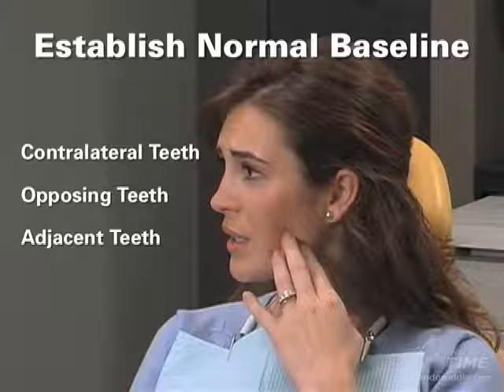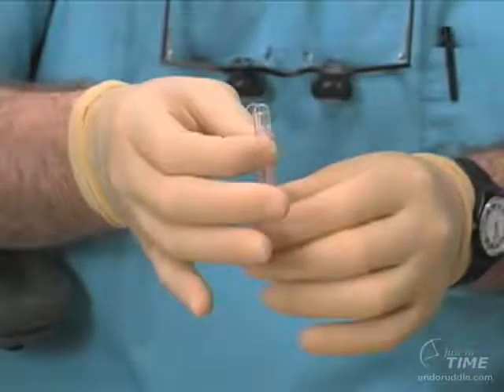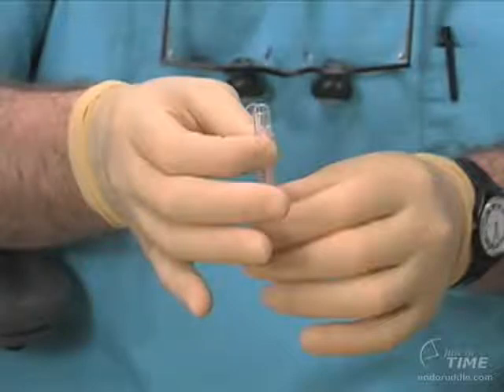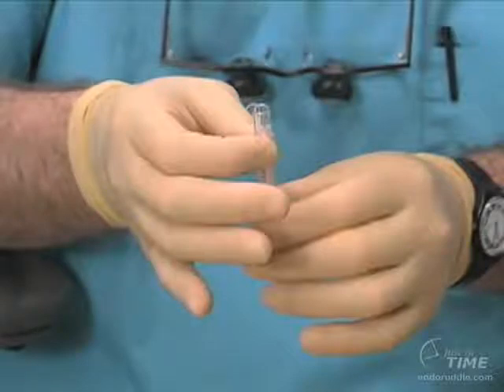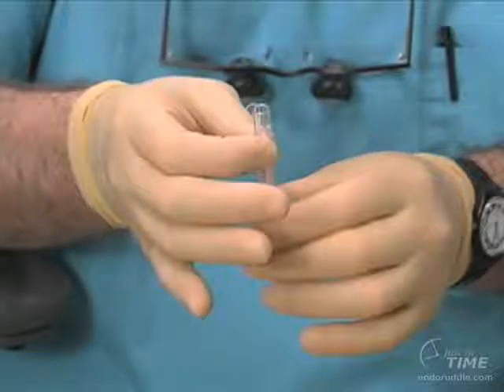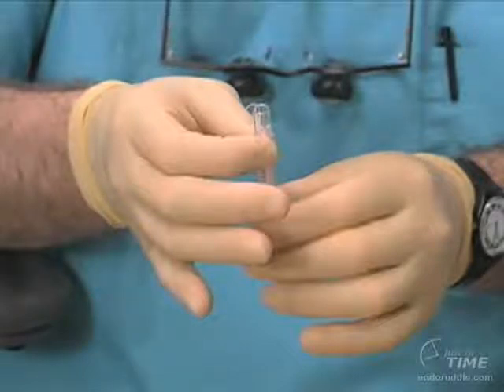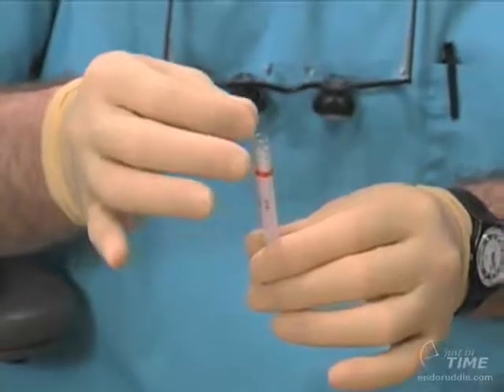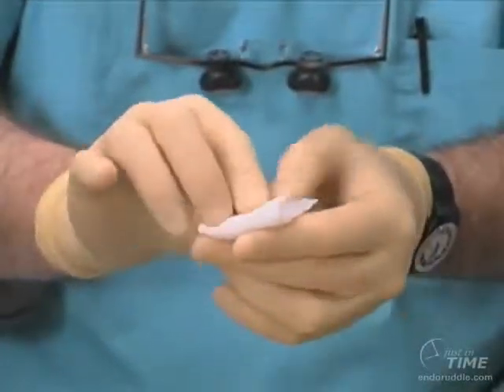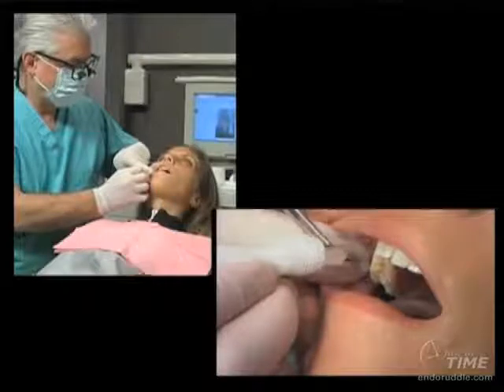For the cold test, my assistants purge anesthetic out of a carpule, cut a piece of floss about one inch longer than the carpule, fill eight or ten carpules with water, and place them in a cup in the freezer. The cup prevents the carpules from tipping over and draining before the water freezes. When you need ice, simply pull out the floss to remove a pencil of ice, then place it in a two-by-two gauze so your fingers don't prematurely warm it. Start on an opposing or contralateral tooth — not the tooth in question.